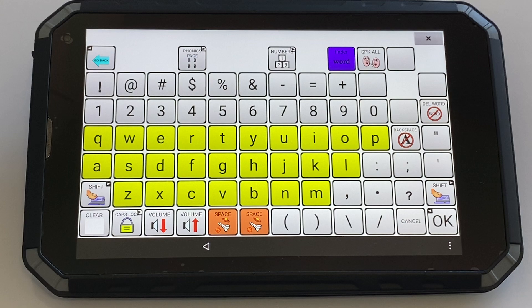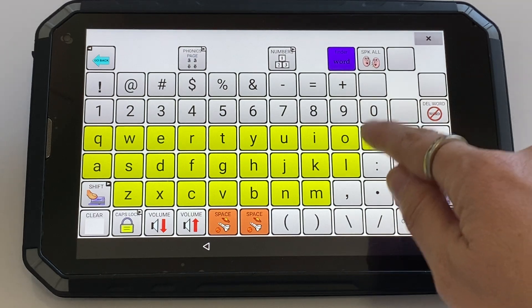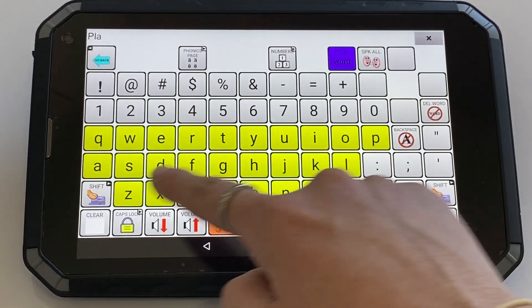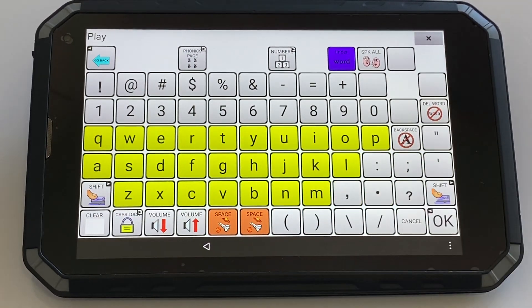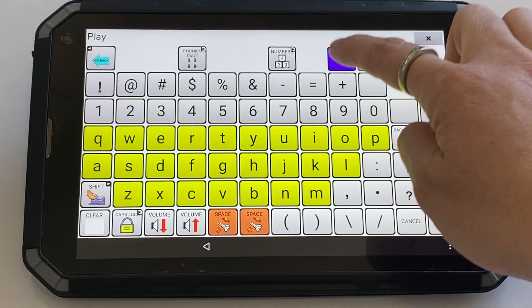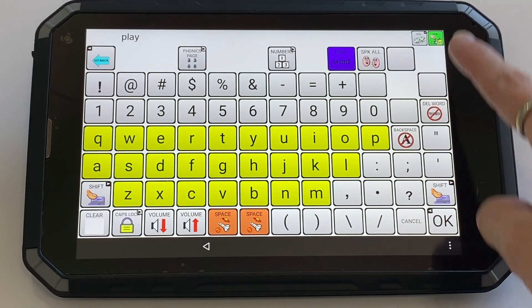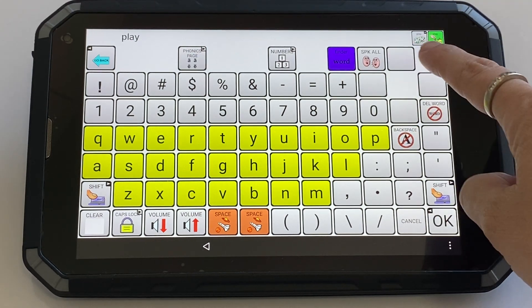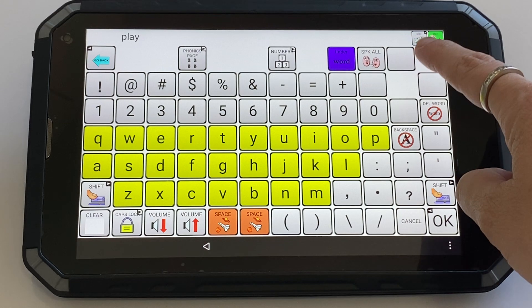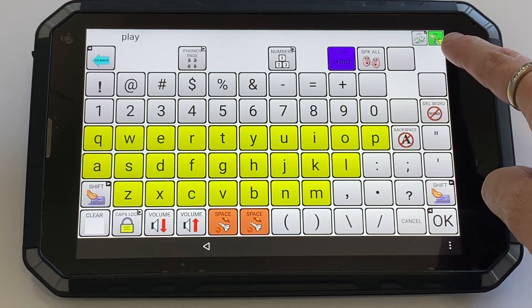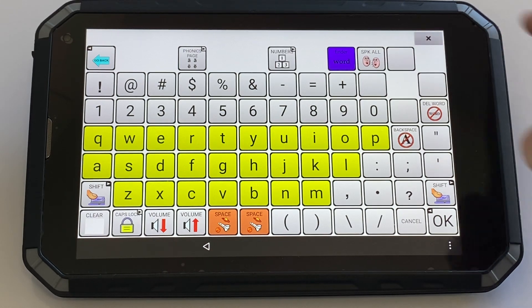You can just type any word you're looking for — for example, P-L-A-Y — and then click on Word Find. In the top right-hand corner it will show you the pathway for how to get to that particular word.